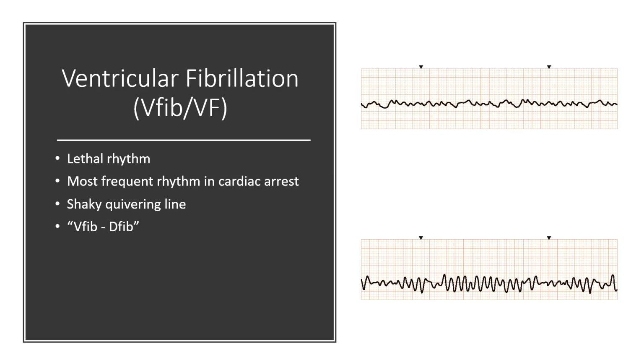So there's specific things when we're going to defibrillate a patient. We want to make sure that it's done as controlled as possible. I know people get really excited during a code. We want to make sure no one's holding on to the patient. We would have a pause: hands off your patient, stop bagging your patient, stop doing whatever, so that they can defibrillate, because you don't want the electrical energy transfer from the patient to anyone that's touching the patient, because we don't want a second victim. So always clear the bed, clear the room to make sure that no one's touching the patient or touching metal or anything where it could transfer.